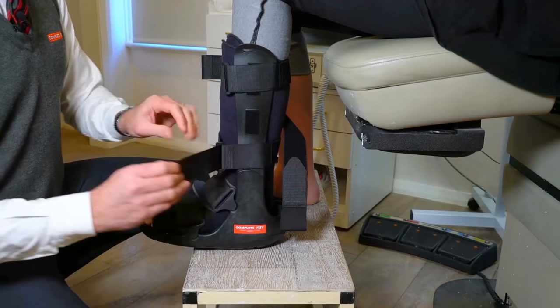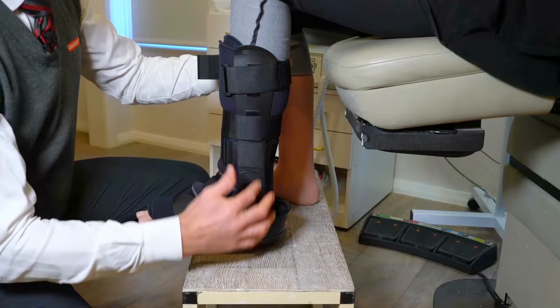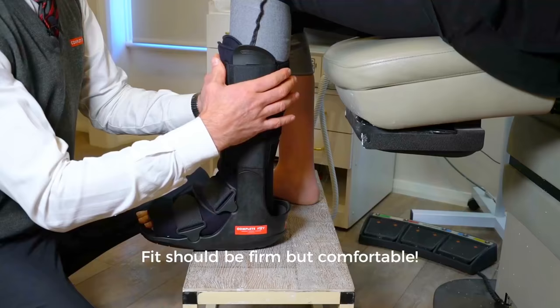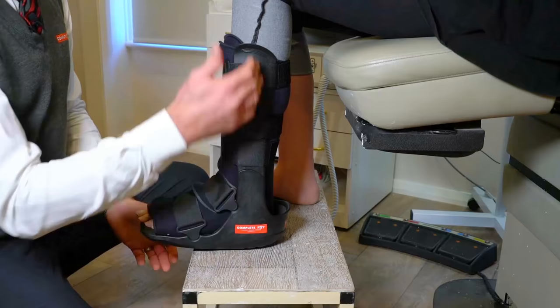That immobilization helps with the healing. These three straps up here are circumferential straps — essentially what they do is pull the uprights into the leg, and that helps take weight from the leg down the uprights into the bottom of the boot. Straps should be firm but comfortable. On the bottom of the boot we have a rocker sole that allows you to transition from heel to toe easily when walking, and that's the reason why we can get you off the crutches.